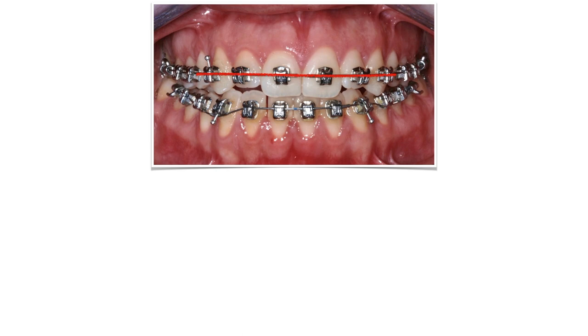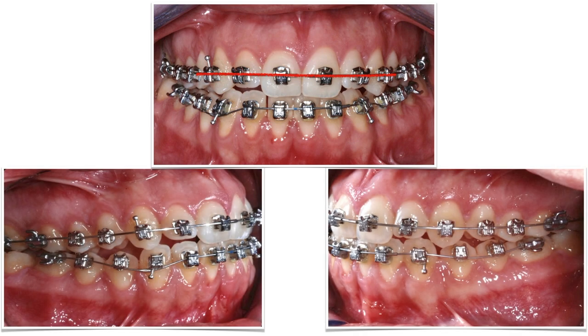There's still a problem though. The lower cuspids and bicuspids don't have proper occlusal contacts with the upper teeth, so we need to find a way to extrude them. We could make a selective rebonding of those teeth, but this solution is way quicker — just bend the wire beneath those brackets to extrude them as much as needed.